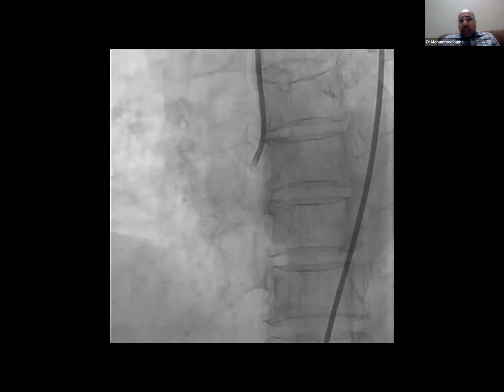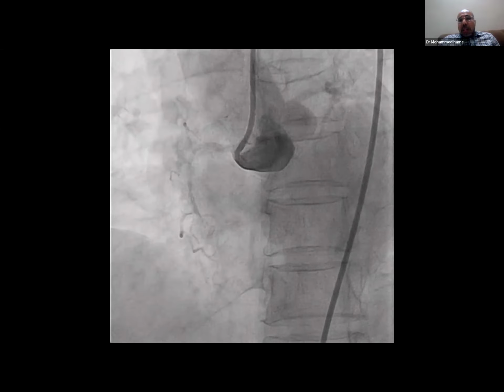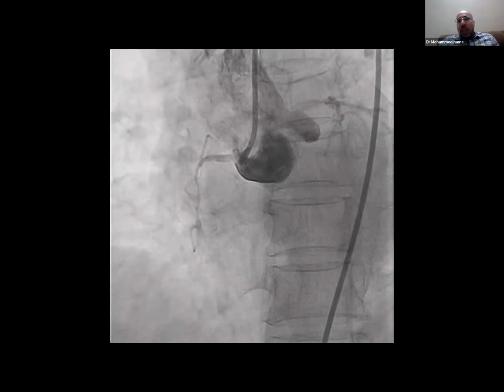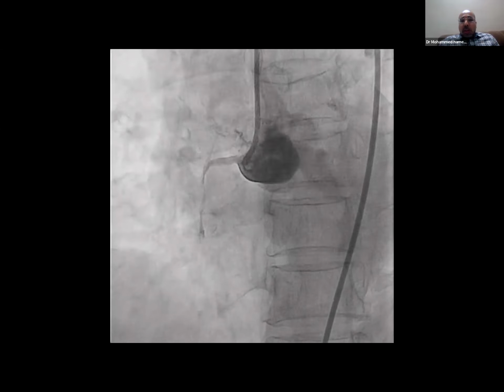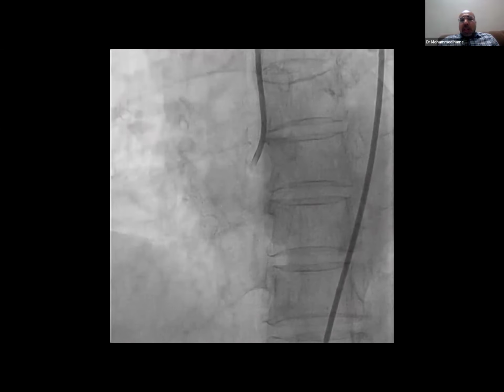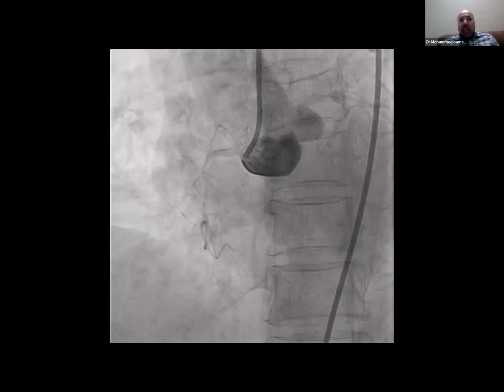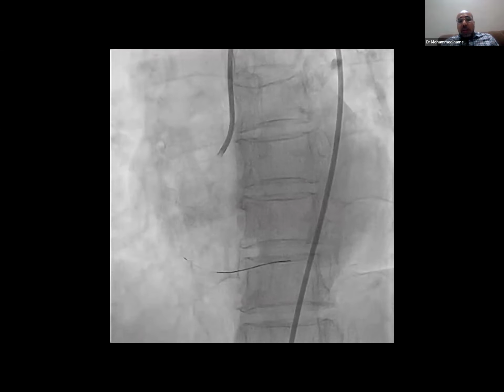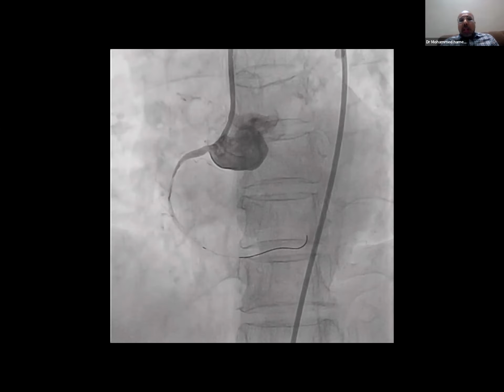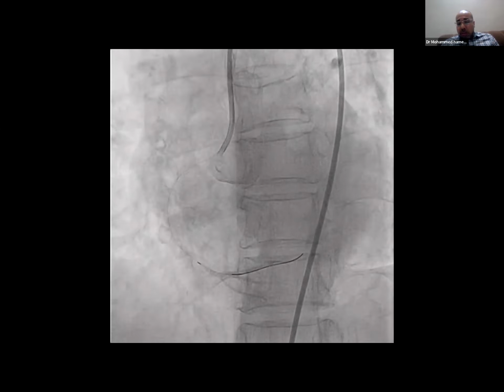Here we have to work fast. This patient had VF. And unlike the usual arrangement in primary PCI procedure, we didn't take an image for the left side. We went directly to the cause of her cardiac arrest. It's the RCA. The RCA was engaged directly with the guiding catheter. It's totally occluded. After passing the wire, fortunately, we have TIMI 2 flow delineating a very long lesion.